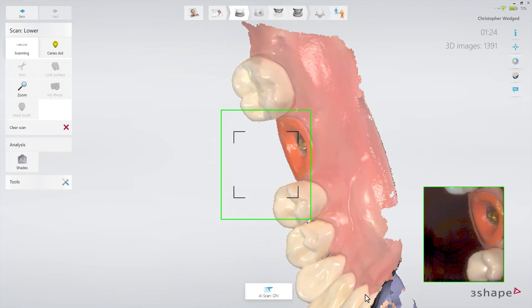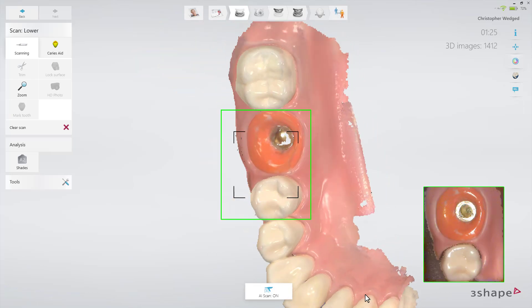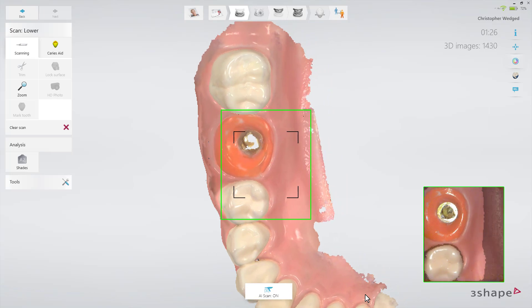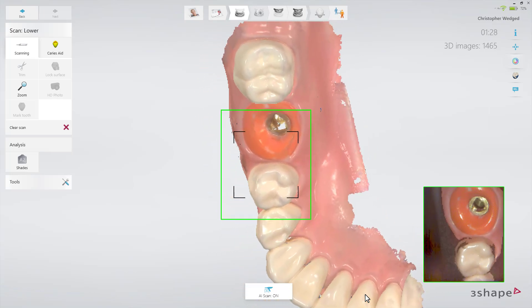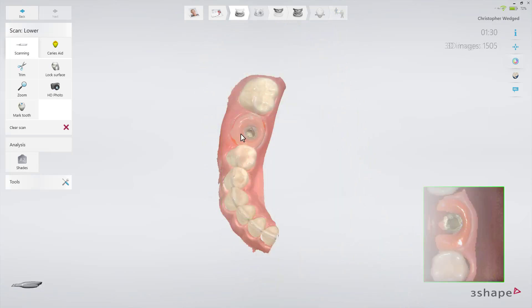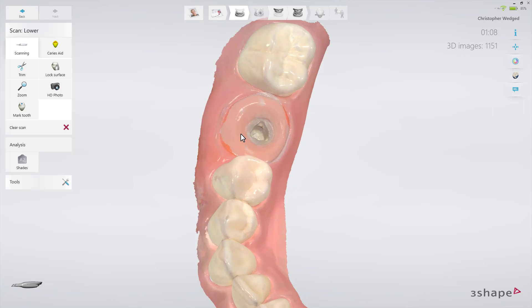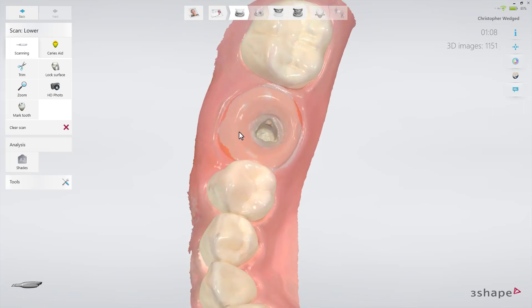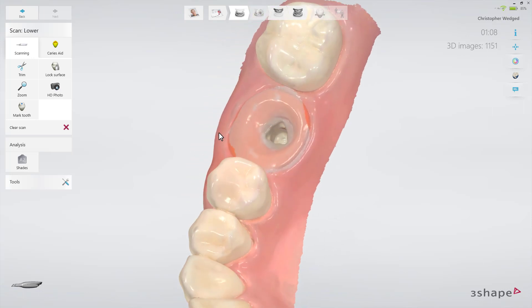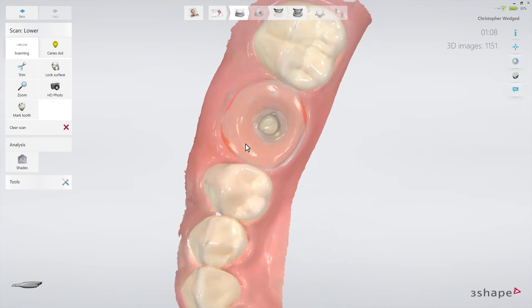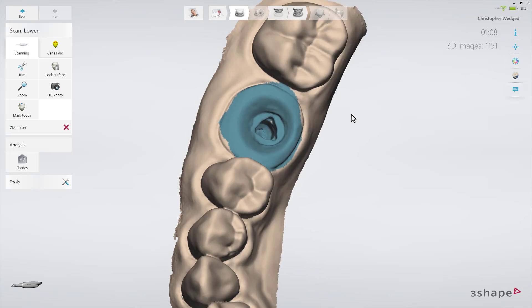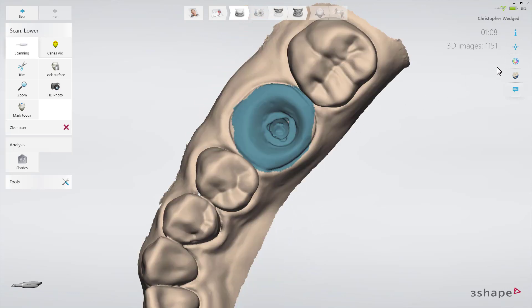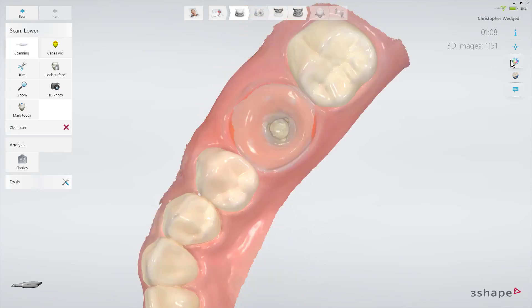No matter which method you prefer, make sure that you cover the Emergence Profile and the contact points in this scan. Verify this by zooming in on the area, turn off colors, and rotate the scan. Finally, mark the preparation.